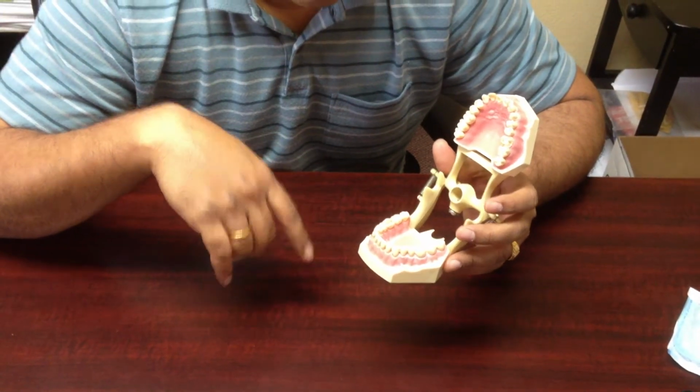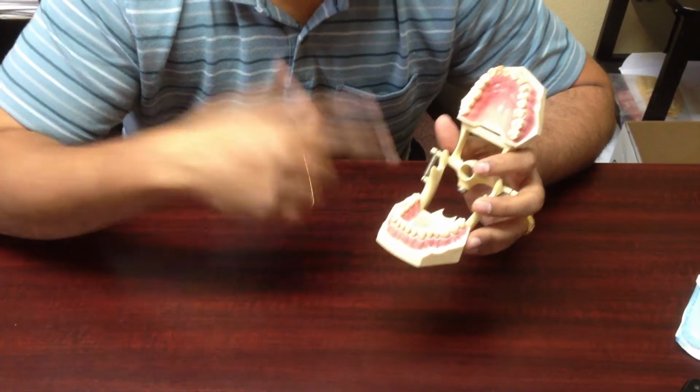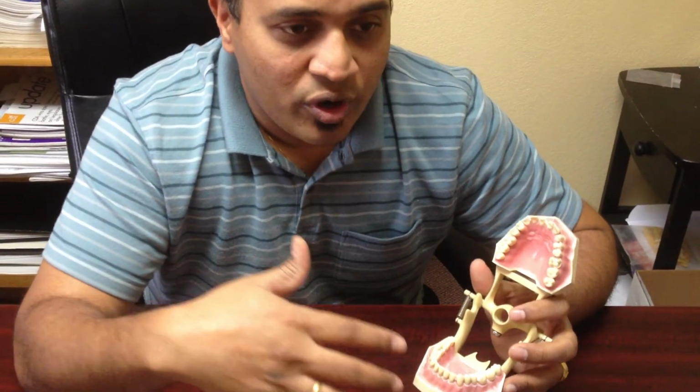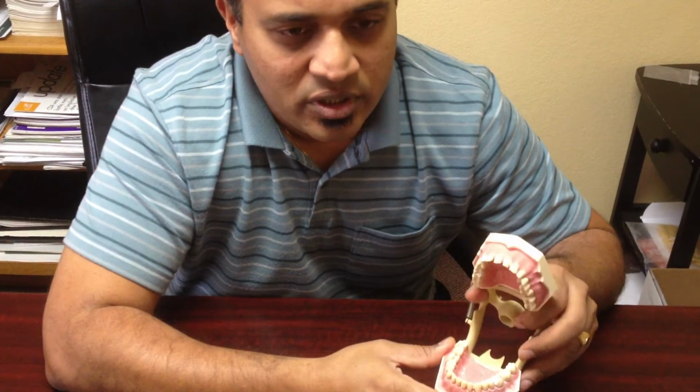So again, my idea is, you have your teeth, and just like a human, my teeth. This is just a mock. It's called a typodont. But in the drawing, we don't have to put the intricacies of the typodont. The main thing we need to show is teeth, kind of like this, bottom and top teeth showing.